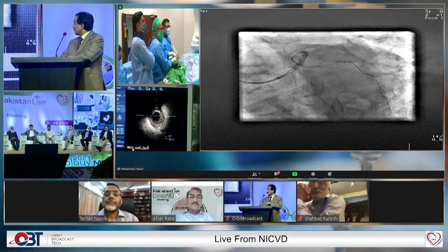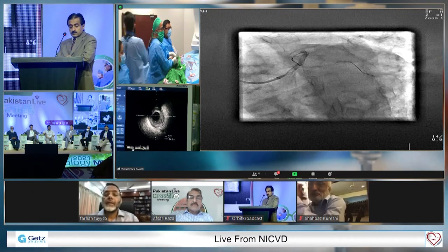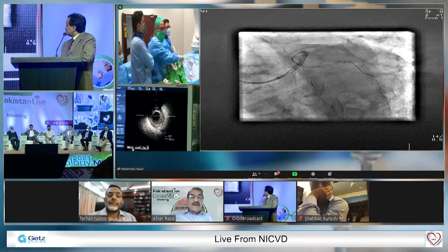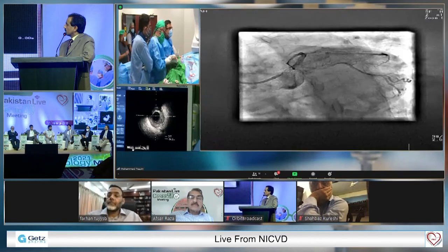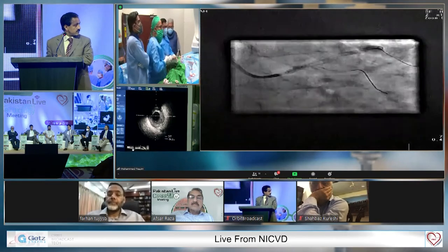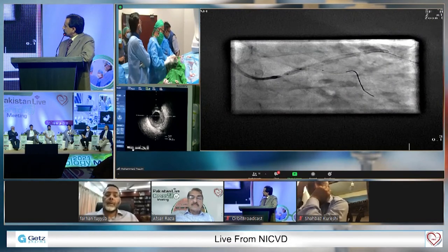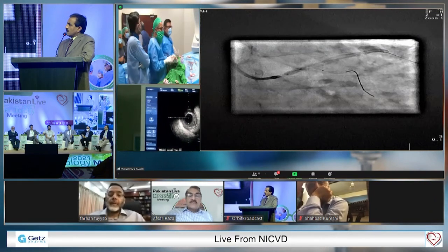At this stage, what do the panelists think? Is everything all right? We are still looking at the still frame. We do not know. If you can, we need a better picture, please. Can you show us the last final shot? I think Dr. Farhan, the decision about circumflex ostium would be easier after post dilatation of the stent in the LAD and left main and rewiring of the LCX. Only then we can decide whether we have to stent the circumflex or not. Before post dilatation, it is a bit early.